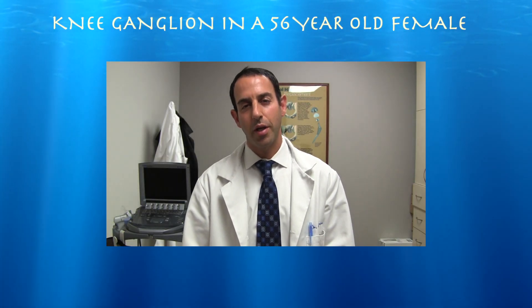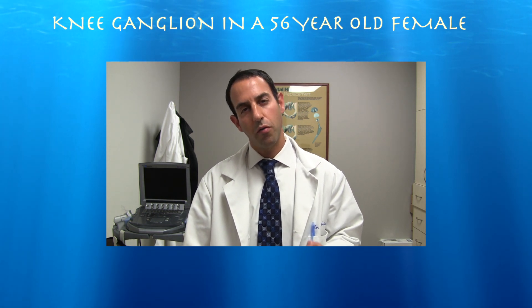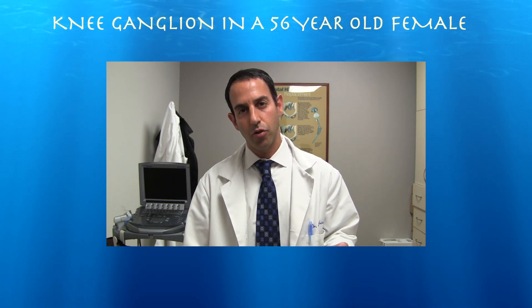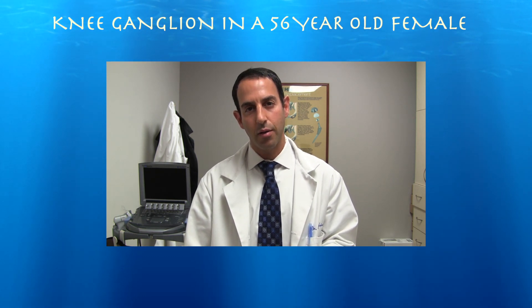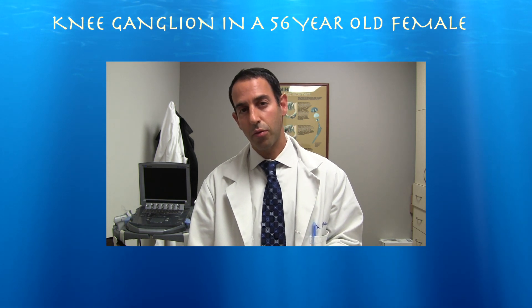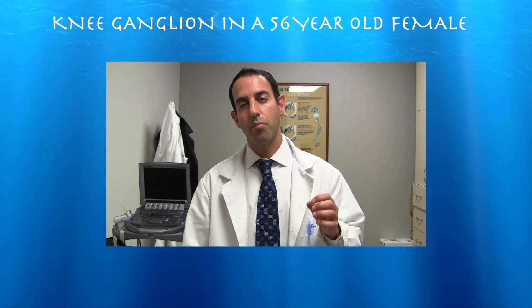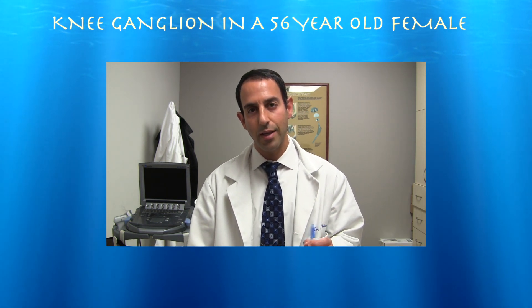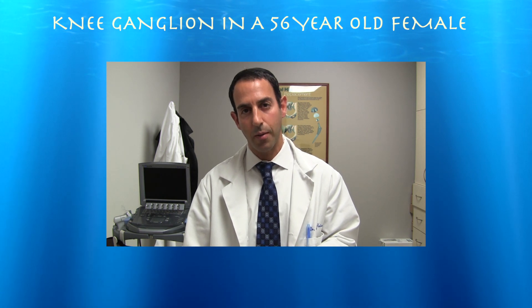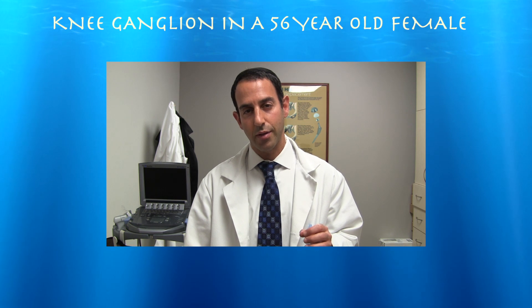Here's the case of a 56-year-old female complaining of about three months of pain in her left knee. She had pain with walking and no mechanical complaints. Ultrasound revealed a ganglion just medial to the semimembranosus tendon. On physical exam, she was tender in the pes bursa region and also in the medial joint line, suggesting some pain referred from this ganglion. It's important not to diagnose this as a Baker's cyst, as it does not lie between the medial gastrocnemius tendon and the semimembranosus tendon — you have to have a fairly keen eye to identify this.